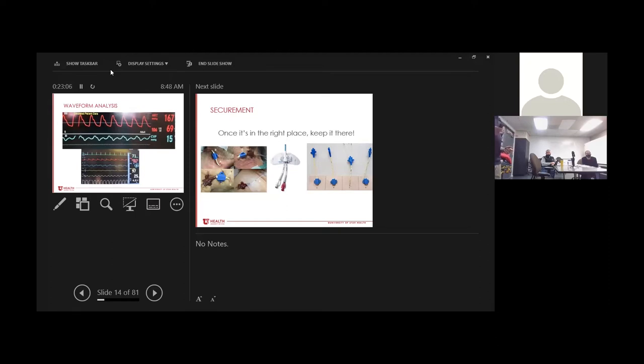This is a venous waveform. They have what are called A, C and V waves. That is not useful for our job. The venous waveform is low amplitude, it's undulating, and even in the patients with the highest CVP you're ever going to see, even if they're tamponading, it's going to be under 40. And realistically under 30 probably. But if you took worst case scenario for someone, in real life, they become pretty easy to differentiate between. You can hook up a transducer to your line, and if it's arterial, you're going to know real quick. Any questions on any of that?